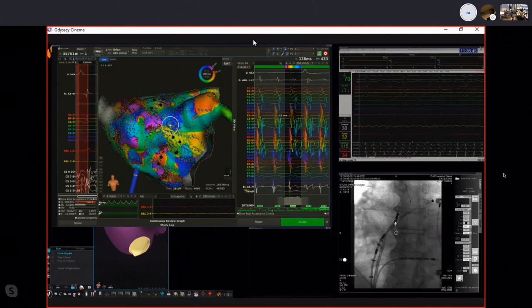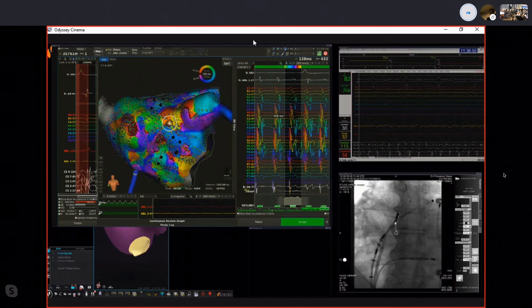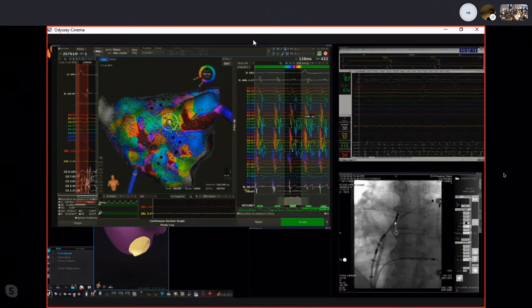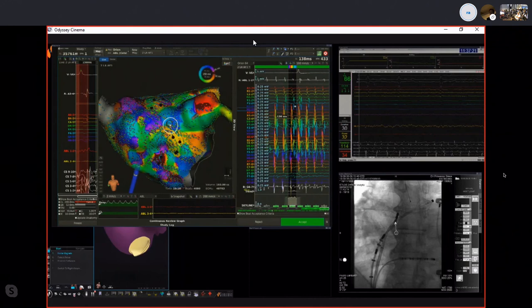And you can see that we have potential within that cycle length for 118 milliseconds. So we have a pretty, let's say, complete coverage for this beat. And if I go on to the following beat, we have almost 100% coverage of the cycle length. And it goes on like this for the following two beats. Now, let me diminish the speed, and you can see how consistent for several beats this is.